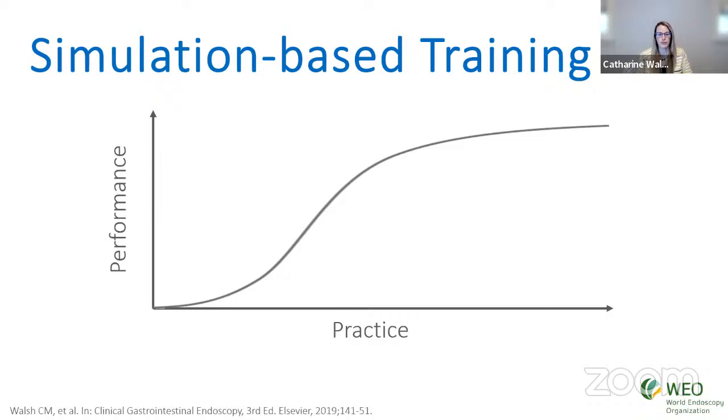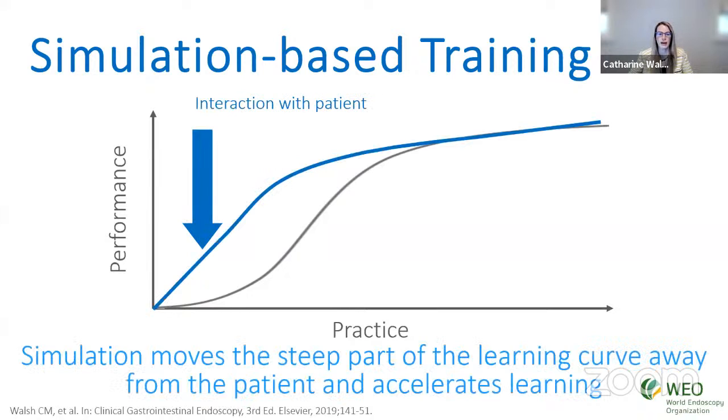In looking at this picture, one can see that in general, trainees improve with practice. And simulation alone does not create experts, as I mentioned. It provides a means for trainees to practice their skills in a safe environment prior to performing the procedures on patients. And as depicted here, simulation allows an individual's performance to move along the learning curve so that they're more proficient at the time of their first patient exposure.